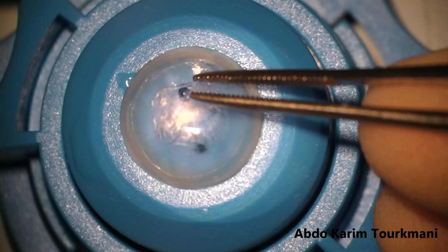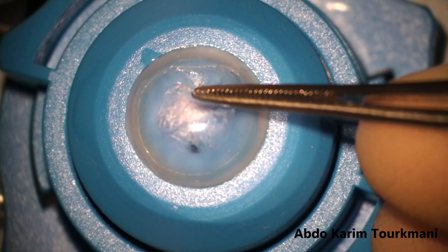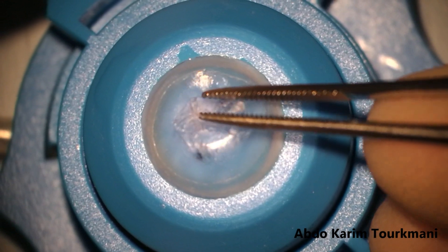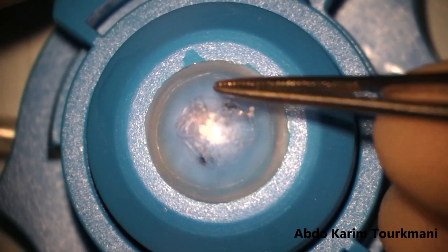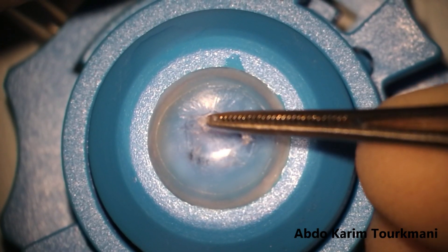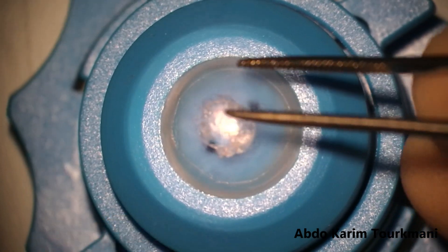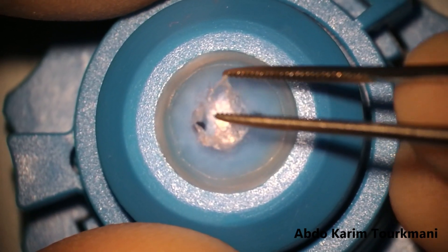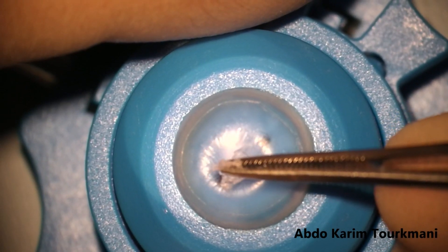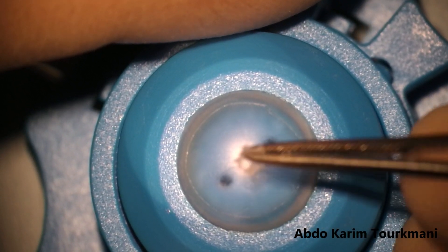So what I do, I just manually dissect around it with a manual dissector, and when I've overcome that micro tear, I just continue grabbing and pulling with my Morphyl's forceps, 360 degrees over and over again. And you can see in this video that I am not lifting when I pull the Bowman layer. I am grabbing and pulling, but I am also pressing down with the tip of the forceps onto the rest of the stroma of the donor cornea, so that I reduce the tension over the Bowman layer.